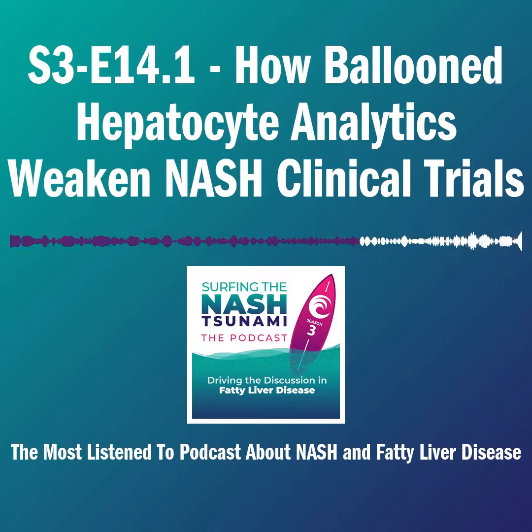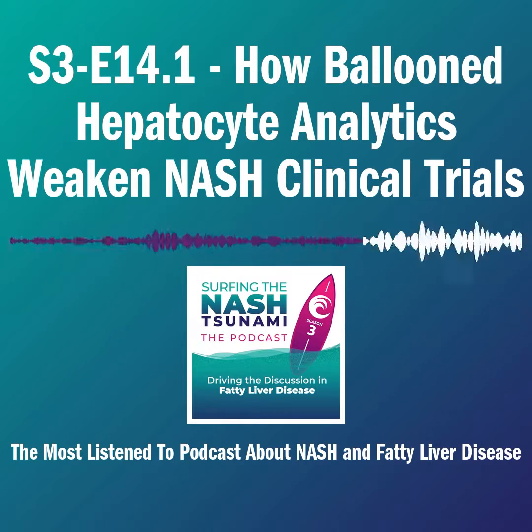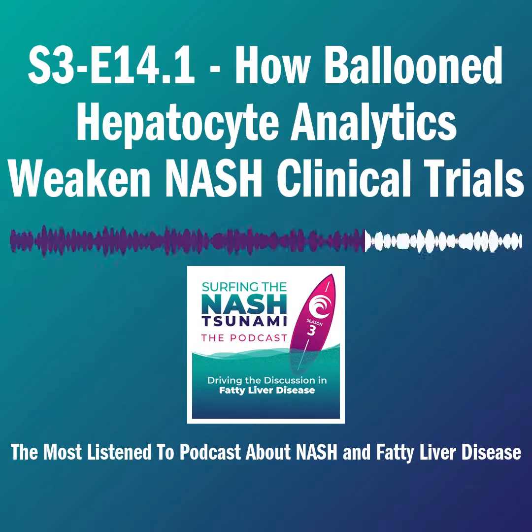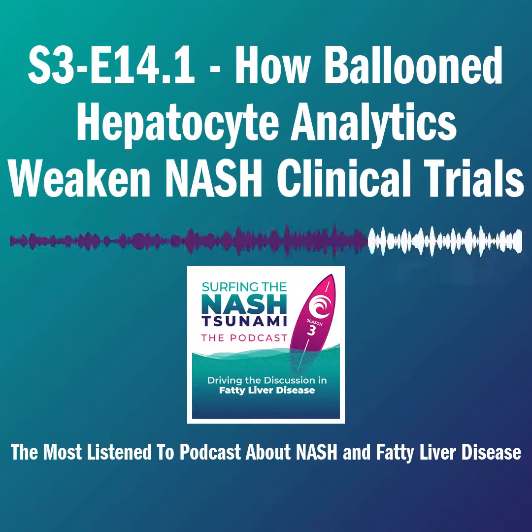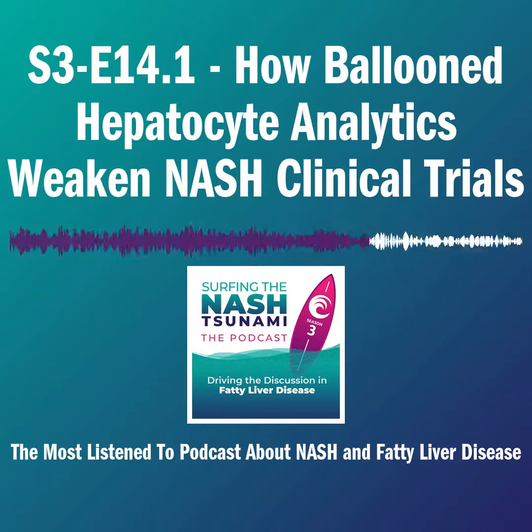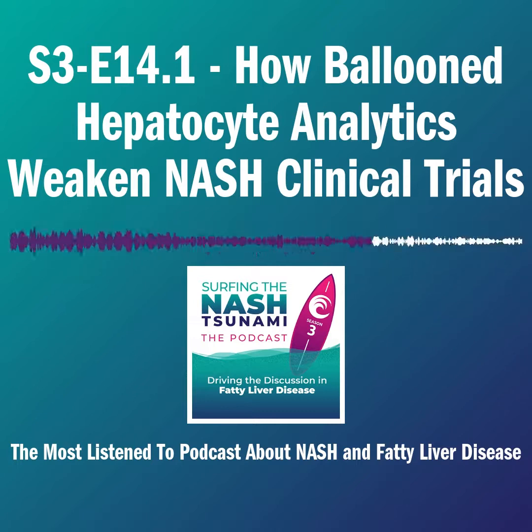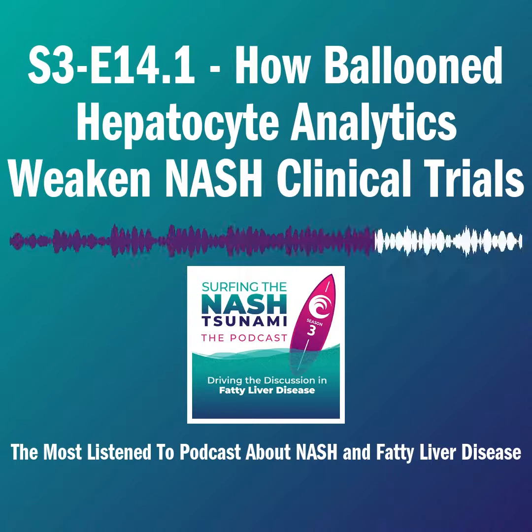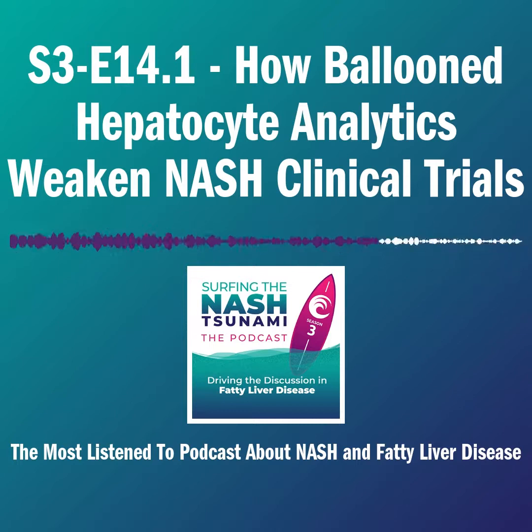But I think this idea of perception, of variation of pathologist viewpoints is critical because it adds to what we already know about the heterogeneity of ballooned hepatocytes. And I think we mentioned this on the podcast before, we talk about 1/50,000th of the liver in a core sample. But what we don't talk about is that usually a core generates 13 to 15 slices, and we only look at one H&E typically of that core. So really we're taking, let's say, 1/14th of 1/50,000th. So we're looking at 1/700,000th of the liver.